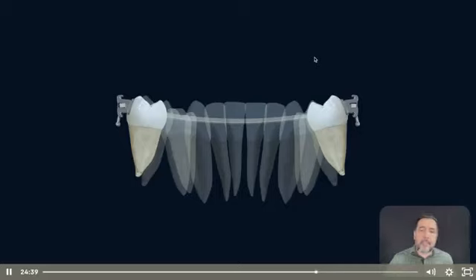In this environment, it won't change the inclination. So in this case, neutral torque will represent no torsion to the posterior segment, no relative torque, what we call a passive torque. This is another spoiler, because we're going to refer to this torque in the next class.